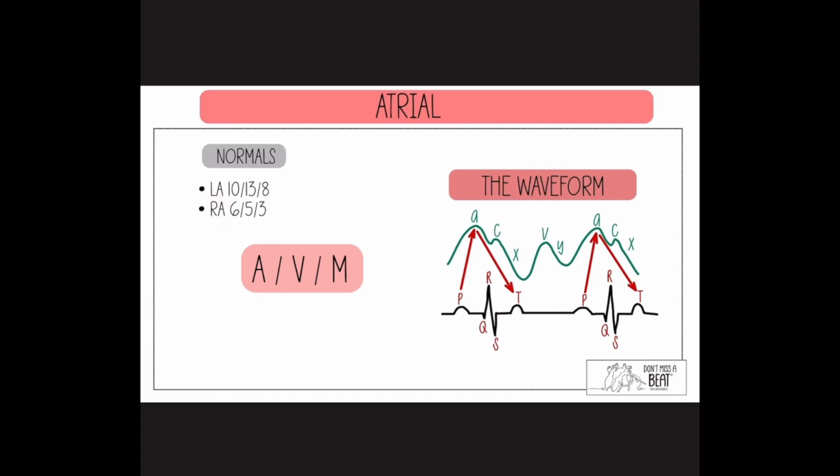Now, the left atrial pressure you might hear as pulmonary wedge pressure, and just what that means is how you're achieving that. Either you're achieving it from a right heart cath and you're wedging the Swan into position to represent the left atrial pressure, or you are going transseptal through the intra-atrial septum and you're directly reading and transducing a pressure from the left atrium. Both are possible. Both waveforms are going to look pretty much the same. And then you have the right atrial pressure that you achieve from the Swan-Ganz catheter.